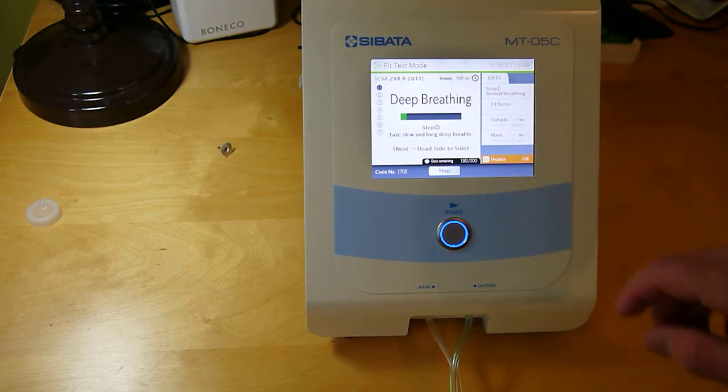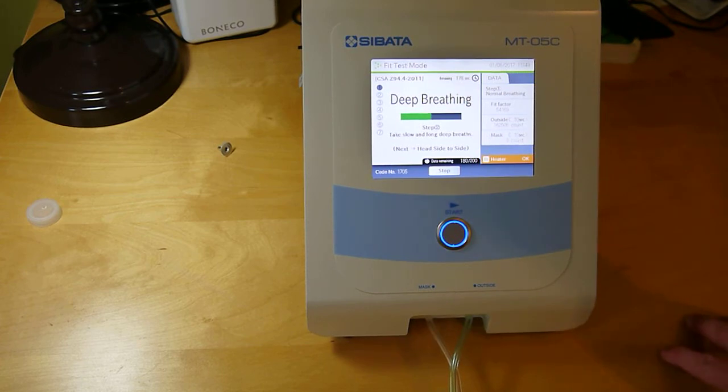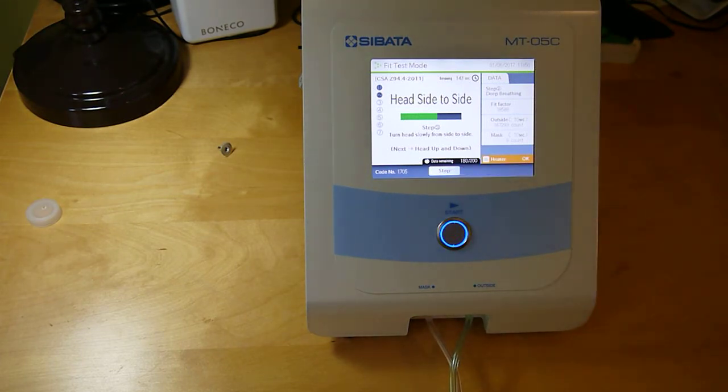After each step you'll see the fit factor result and the time remaining. There are seven steps total. The next step is head side-to-side — don't move too quickly. They may want to hold the tube so the extra weight doesn't pull on the mask. Turn to the side, take a breath, turn to the other side. Then head up and down — full range of motion, not too fast — and they can hold the tube again so its weight isn't pulling down on the respirator.